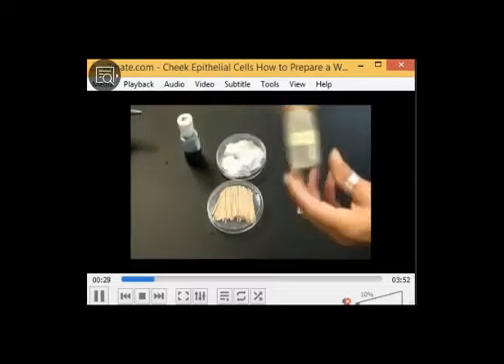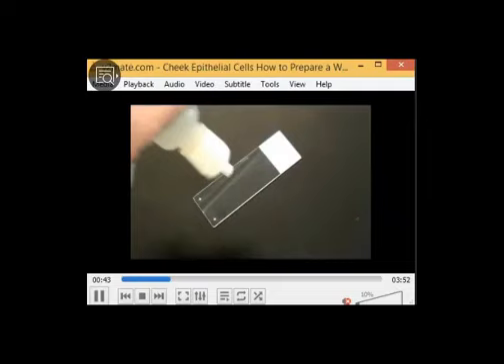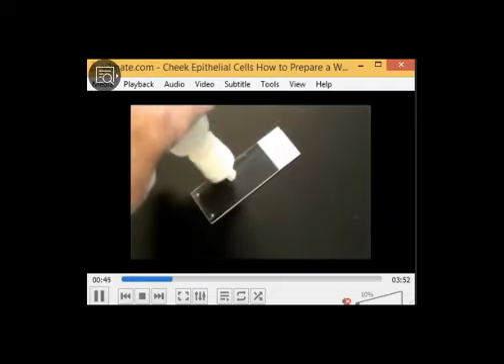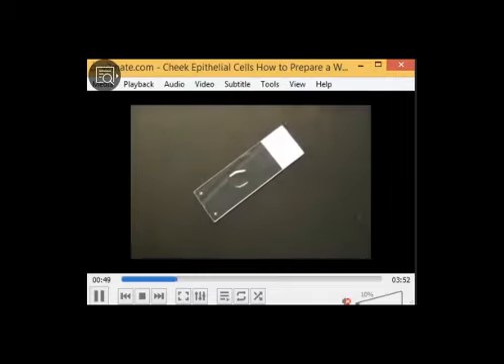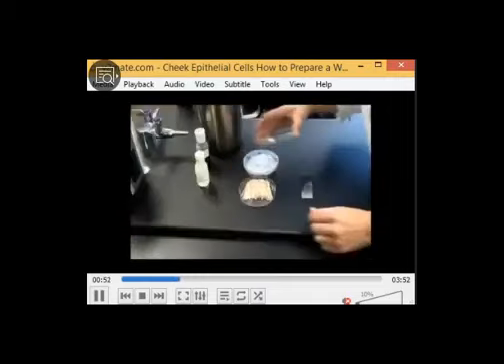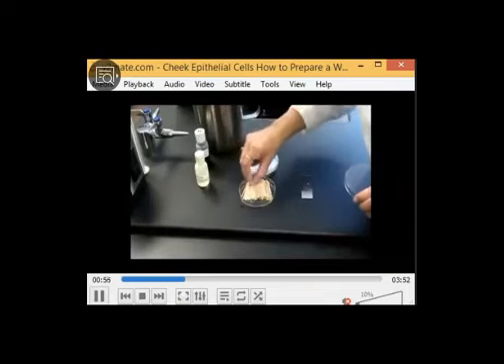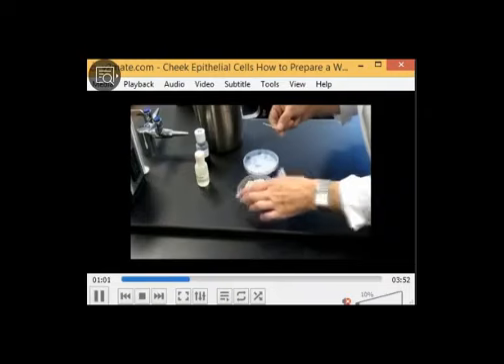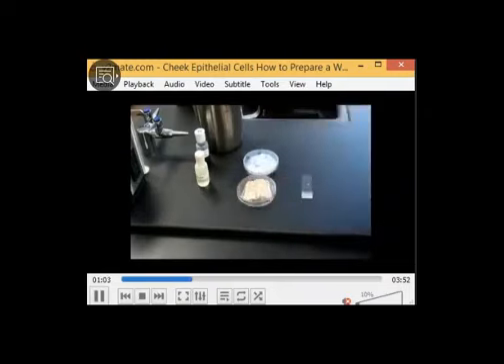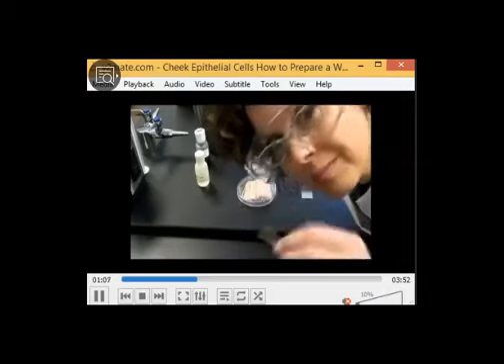So he will take water. He will put one or two drops of water, aina bil moya, ala shariha. Now he will take a toothpick, yani khashab asnan, and see the procedure. She will put it in her mouth, on the inner side of the mouth, and just roll.